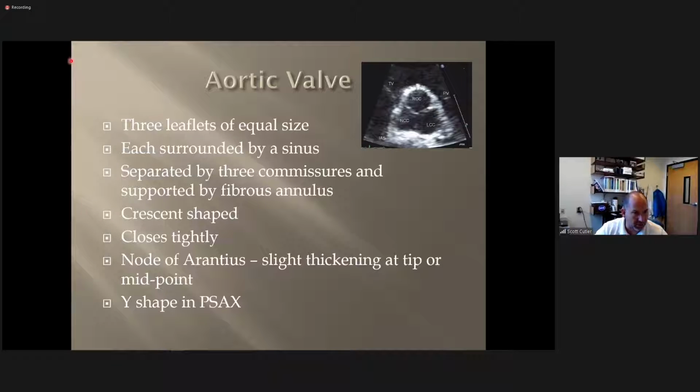So that's supported by that structure. The aortic valve in long axis, I should specify that, is crescent shaped. So crescent being kind of like a half moon shape. The valve should close tightly. It should not leave gaps.